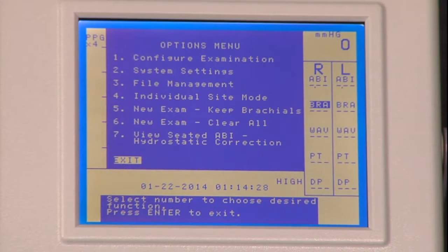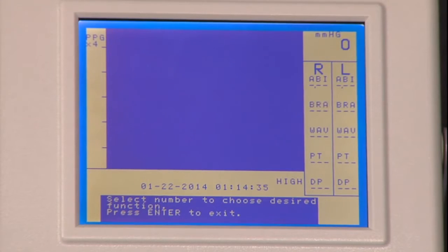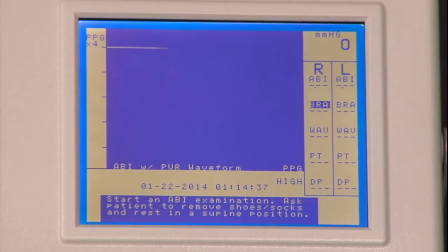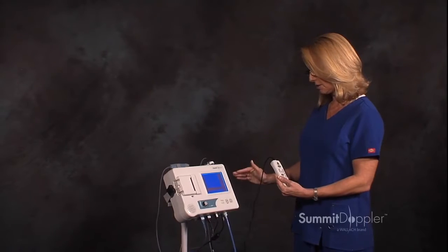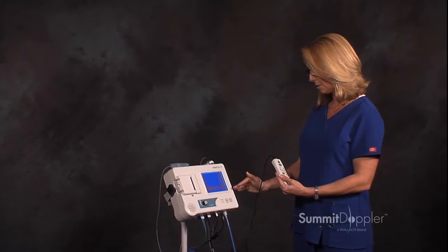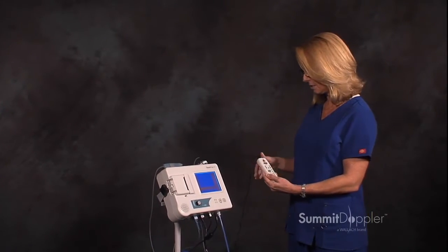And again for the options menu. Pressing number five — new exam, keep brachials. That would be used when you have performed an exam and want to redo your pressures at the ankles but want to keep your brachial pressures.